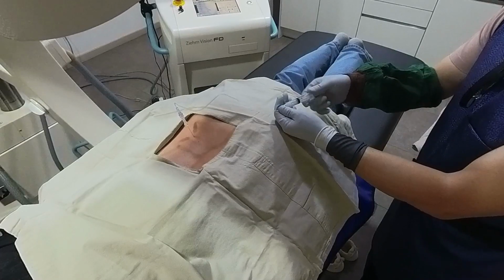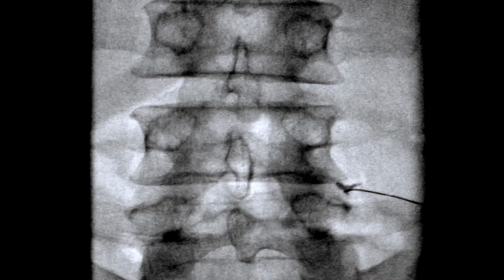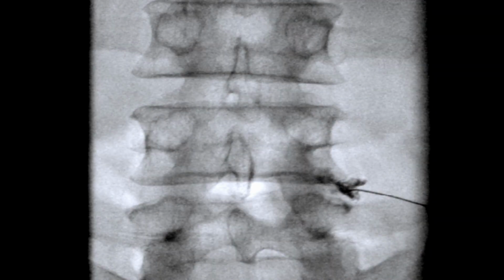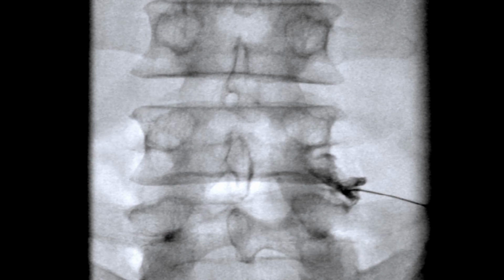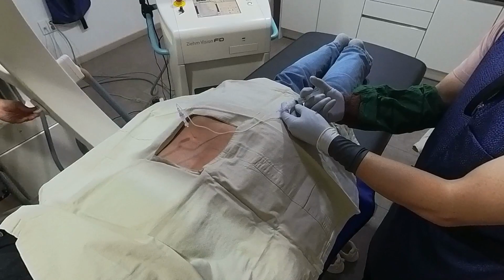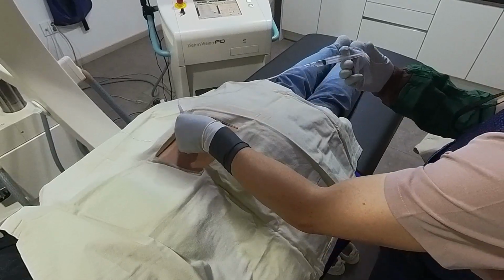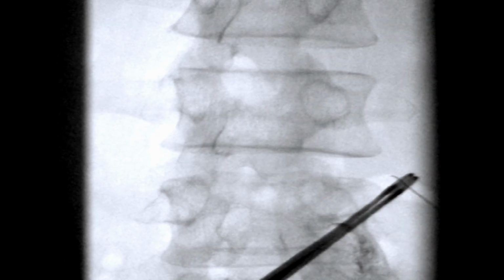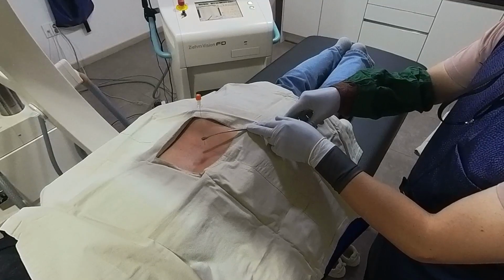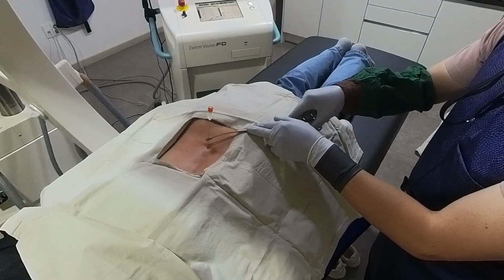To inject the contrast media, I use an extended mini-volume tube. This measure allows for better control and minimizes radiation exposure to my hand. Upon injecting the contrast, I observed it spreading more upward than anticipated. Even though I intended a retrodiscal injection, the contrast displayed more of an infraneural spread. Nonetheless, the therapeutic outcome between the two approaches is similar, so I wasn't particularly concerned.